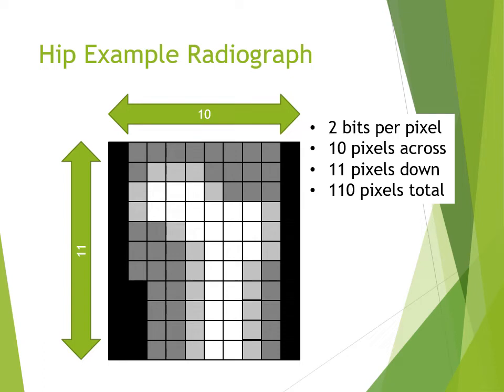If I fade the outline of the hip, with some imagination you can see this is indeed a hip image, but with very low resolution and limited dynamic range, or few shades of gray.